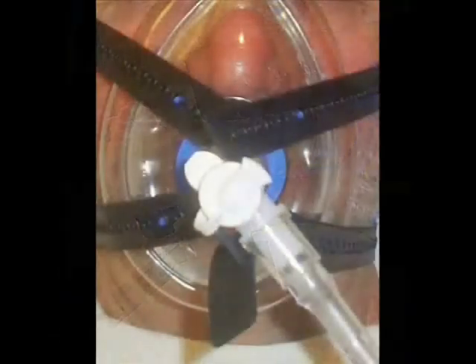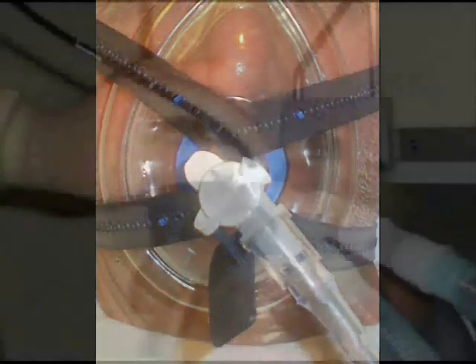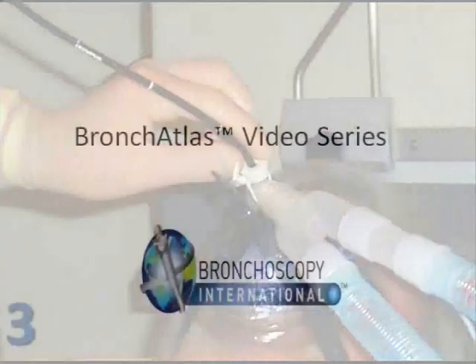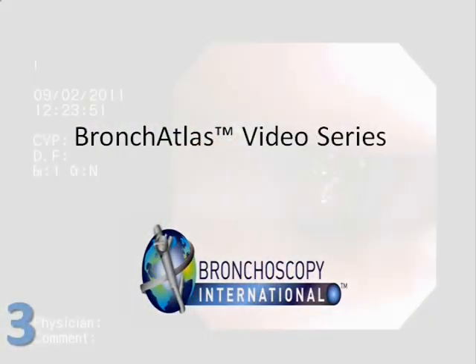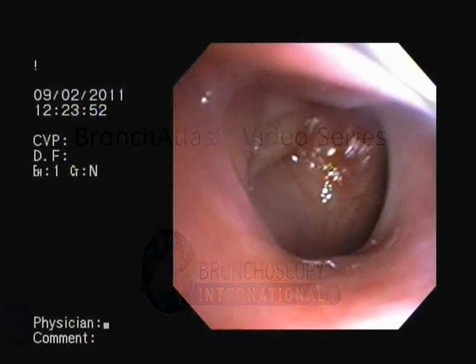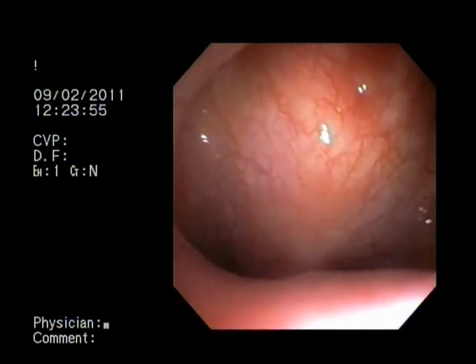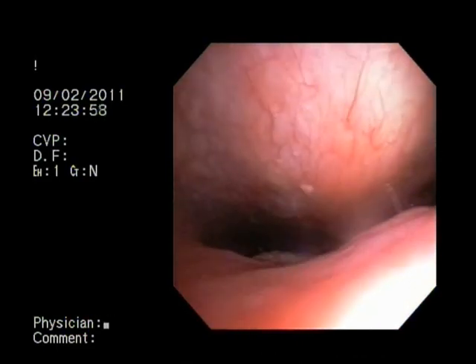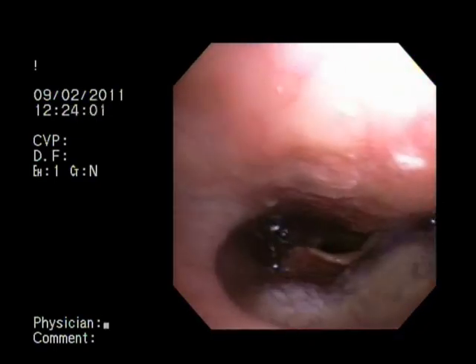A CPAP mask with a swivel adapter is placed on the patient's face. CPAP causes pneumatic splinting of the upper airway, improving visualization of the larynx and vocal cords.